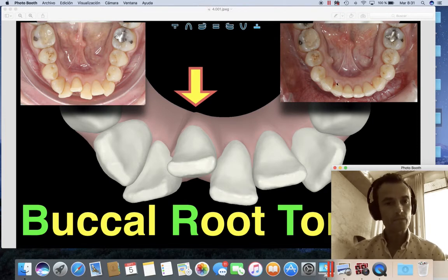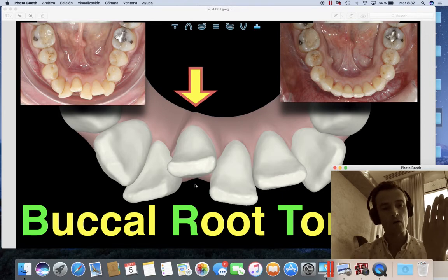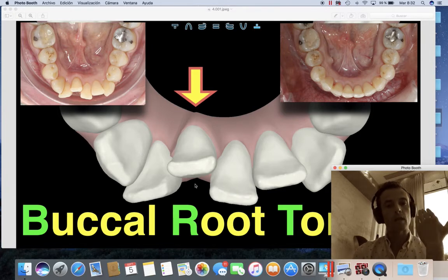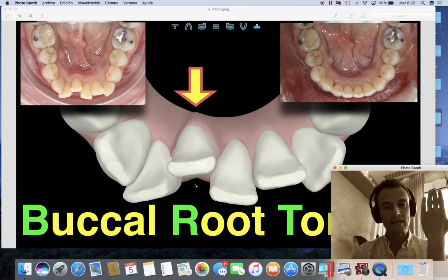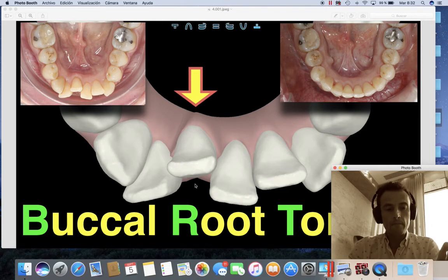Typically if we push the central incisor to the front — as you can see in the arrow — the pressure of the aligner is going to incline the crown, but it's going to maintain the root. So if we just tell the technician that we want to procline the central incisor, what we get at the end is alignment in the crowns, but the root will stay on the lingual surface.